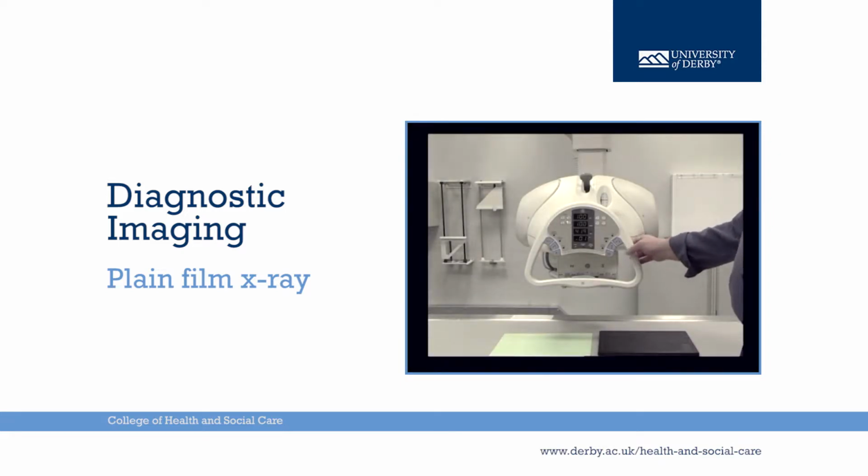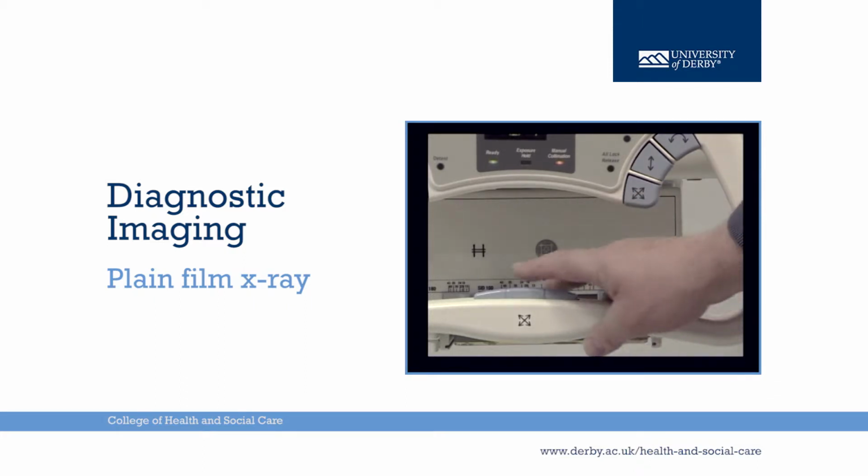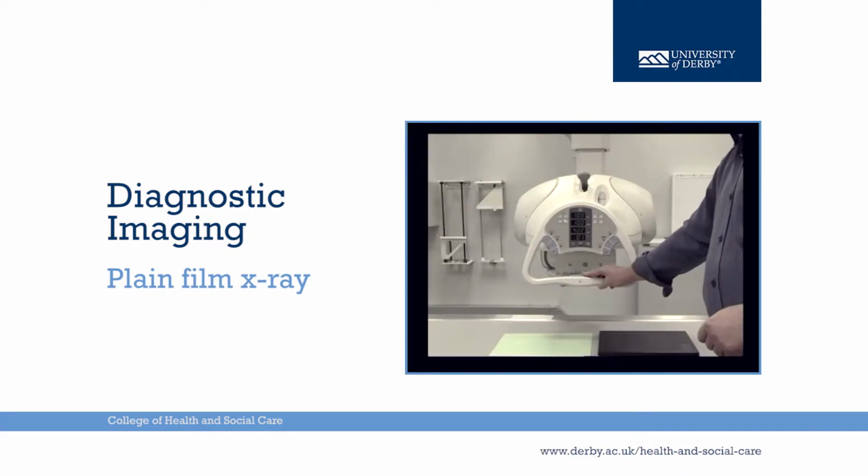The control panel on the X-ray tube has 9 features on it and allows for different movements of the tube head itself. The first button is the all locks release button, which works the same as the button on the handle itself. This allows the tube to be moved in all planes and all directions.